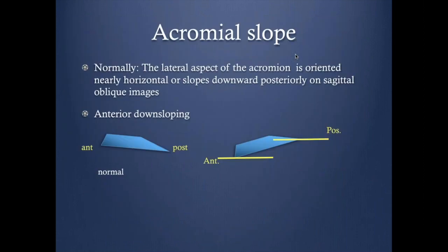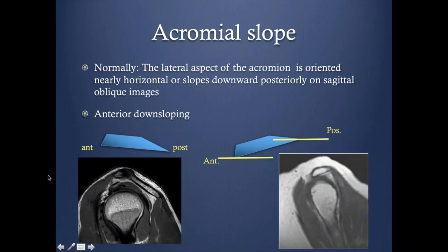Anterior downsloping of the acromion is seen only in the sagittal plane. Normally, the anterior part of the acromion is higher than the posterior part. Anterior downsloping is the opposite — when the anterior part is lower than the posterior part — and this is at risk of causing impingement. This is what we call anterior downsloping of the acromion.